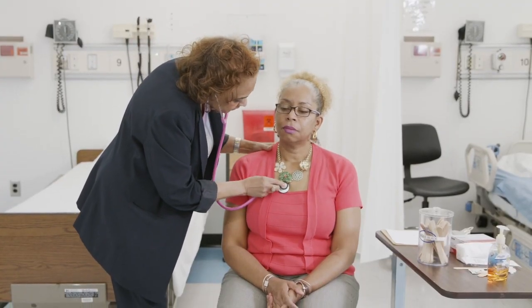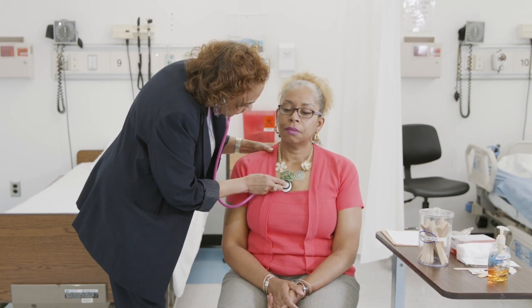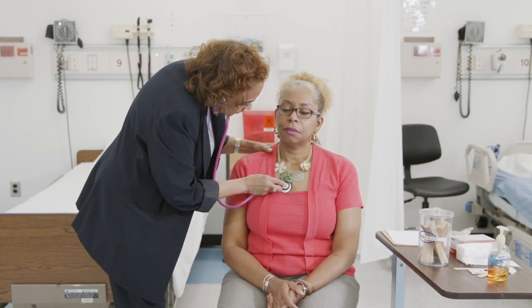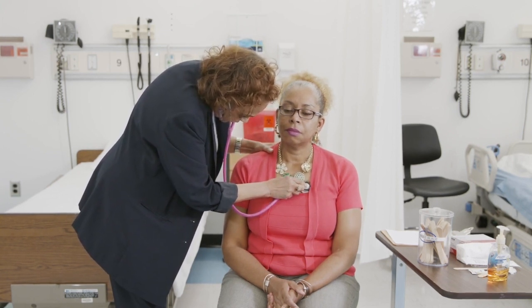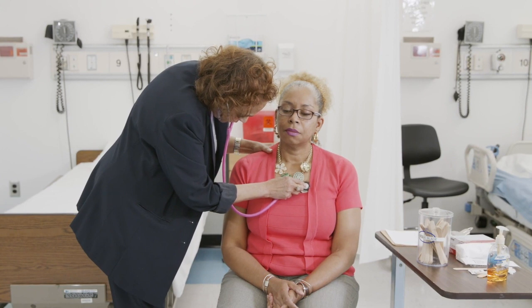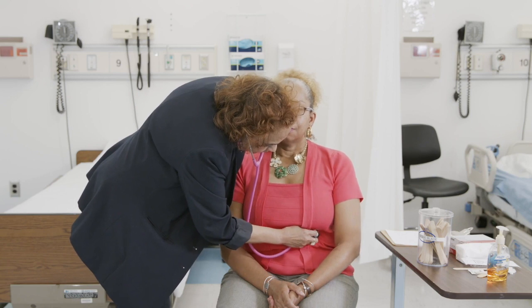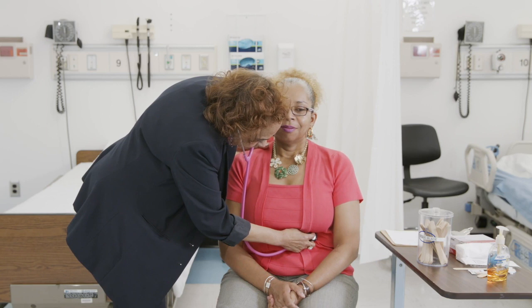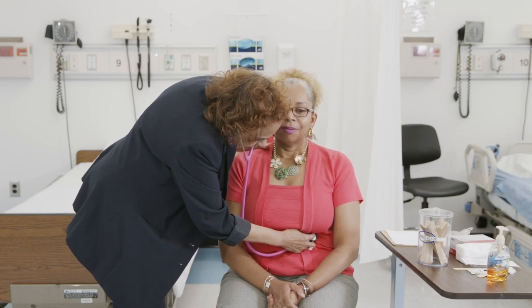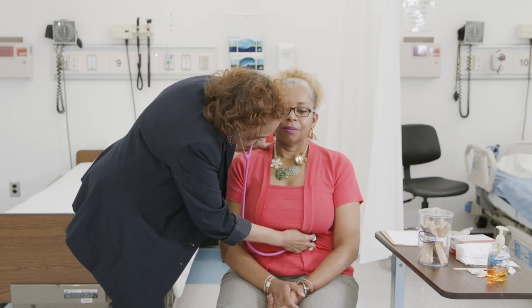At that point, you will use your stethoscope to auscultate the lungs and the heart sounds. You will begin with the anterior portion of the chest and you will take your stethoscope and move to the different locations that will give you different sounds at each location. Once you have done this, you will then ask the patient to take deep breaths. With each breath, you will listen to the patient's lungs. You will move your stethoscope beginning at the top front of the chest, just moving symmetrically as you listen.